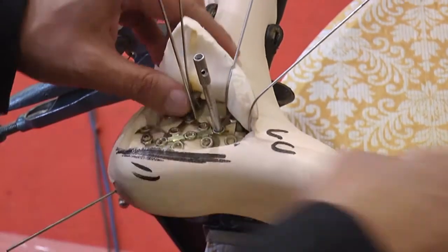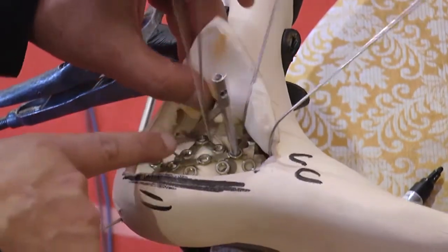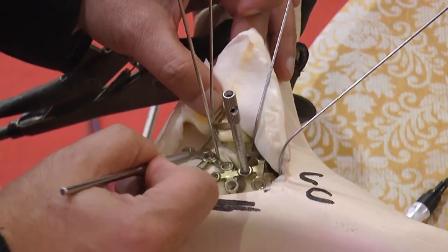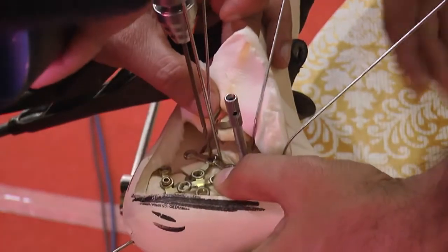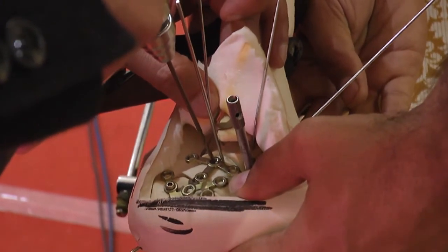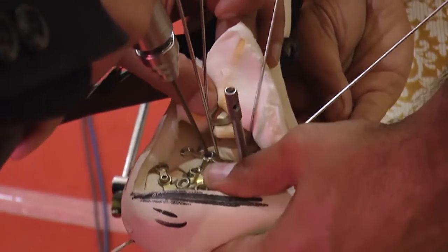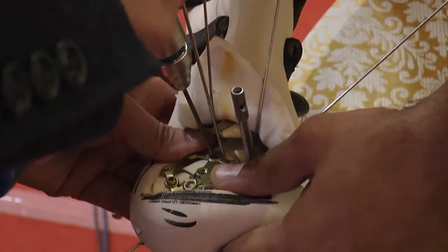This is a sustentacular screw, 2.5 drill bit. Close to the wire, there is a hole which can very easily take a sustentacular screw. That is an ideal location, about 5 to 10 millimeters below the level of the joint. As for the direction, put your drill bit perpendicular and then bend your drill bit posteriorly a bit and plantarward about 10 to 15 degrees. Every time you do this, you do a woodpecker technique, in, out, in, out, in, out, and monitor the drill progress in the C-arm.